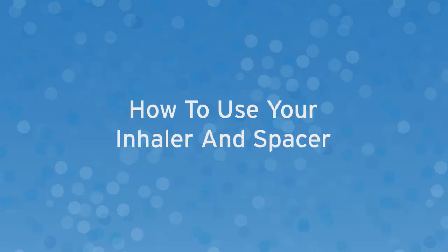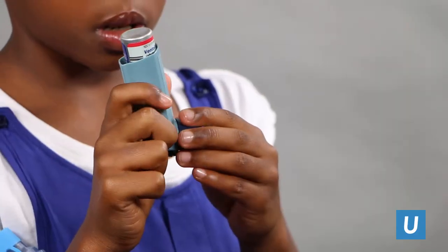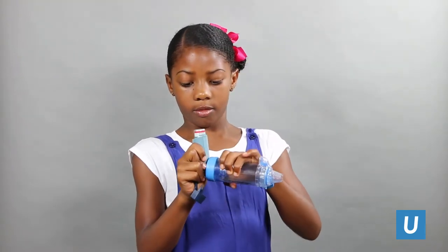How to use your inhaler and spacer: shake the inhaler for 10 seconds, take the cap off the inhaler, ensure the cap is off the spacer, then attach to the spacer.